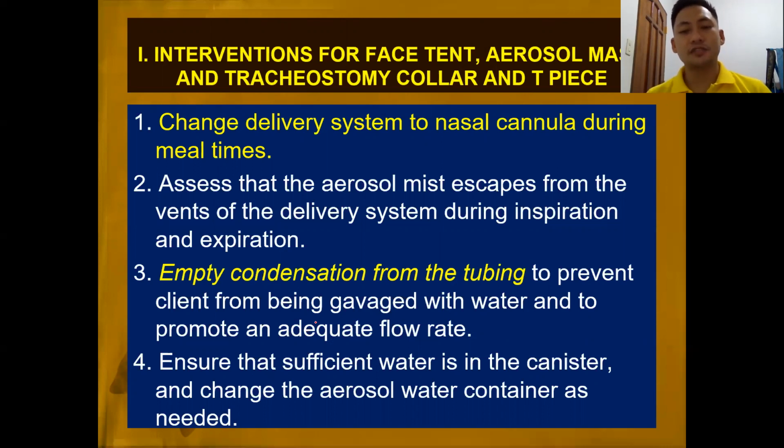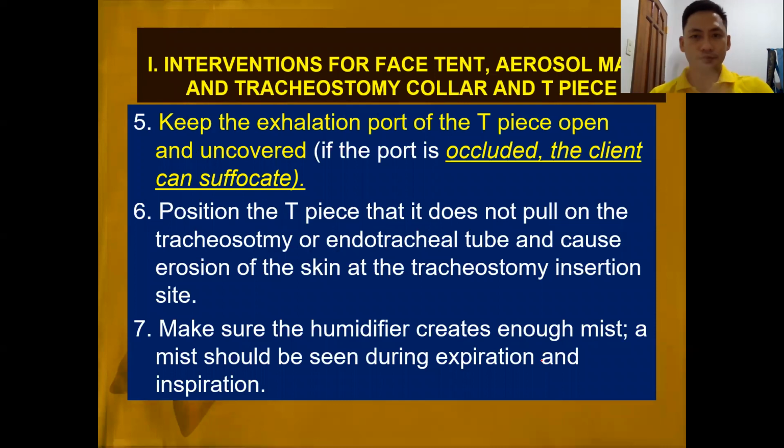Empty condensation from the tubing to prevent the client from being gavaged with water and promote adequate flow rate. Ensure that sufficient water is in the canister and change the aerosol water container as needed. This is for face tent, aerosol, and tracheostomy collar. Keep the exhalation port at the T-piece open and uncovered. If the port is occluded, the client can suffocate.